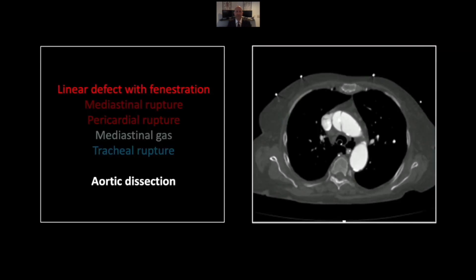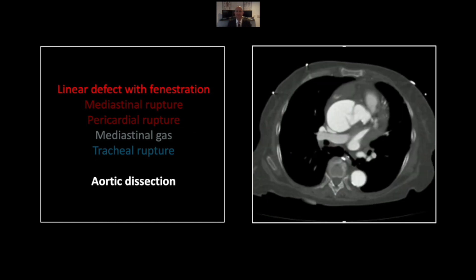Our next case is an aortic dissection with many complications. Here is the flap in the upper portion of the ascending aorta. You can see a fenestration within it, suggesting there's free flow between the true and false lumens. Lower down, in the region of the aortic root, you see another flap with another fenestration. Obviously there is dilation of the aorta at this level as well.